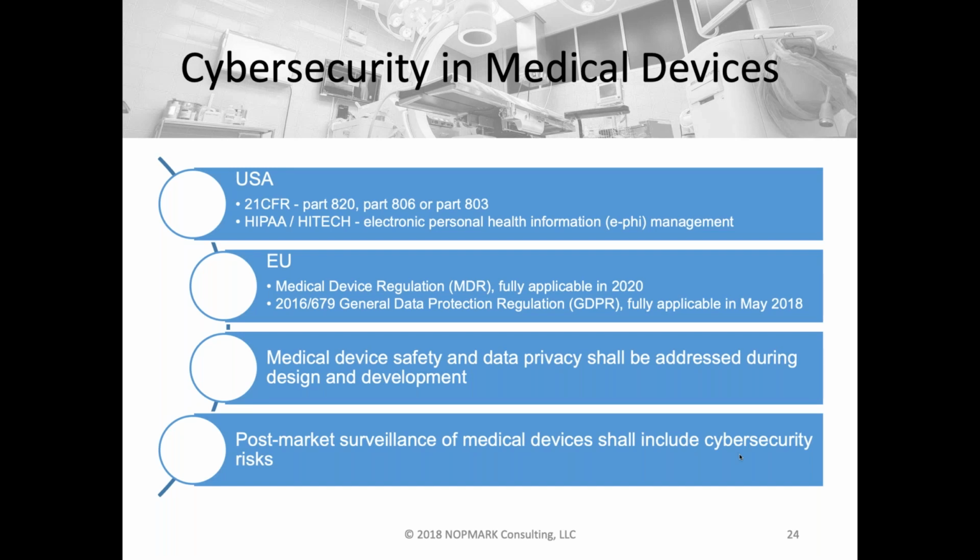In the last 2 to 3 years, the guidances out there have more than quadrupled, both in the US and in Europe, under something called the medical device regulation. So there's even greater emphasis today on this aspect of cybersecurity.